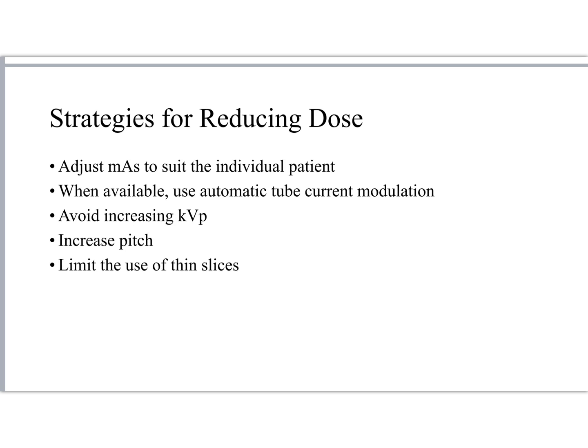So perhaps an education point might be, what is the first line? What's the diagnostic criteria? Yes, we may need to do a CT, but does it need to be the first line of exams that we do, or could we do an ultrasound for deep vein thrombosis on a pregnant patient? So understanding those kinds of justification questions is helpful for navigating the CT interprofessional communication dynamic.